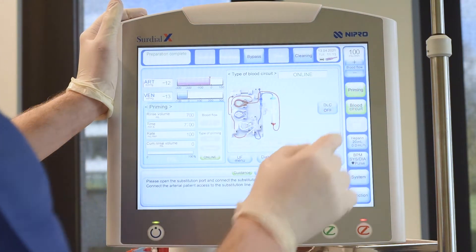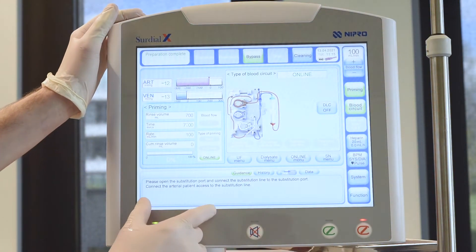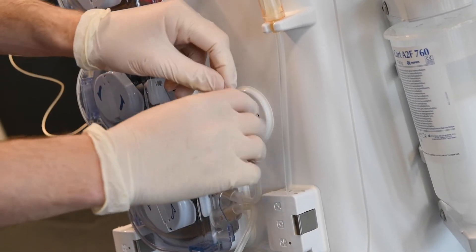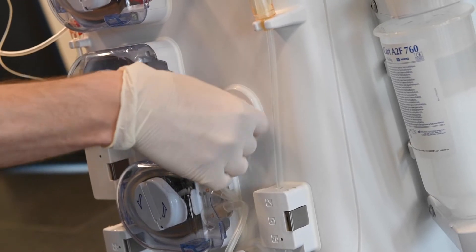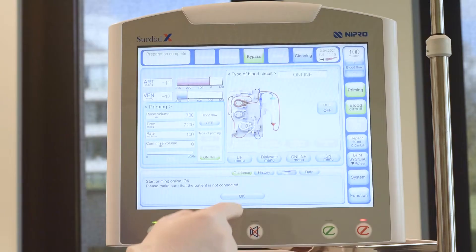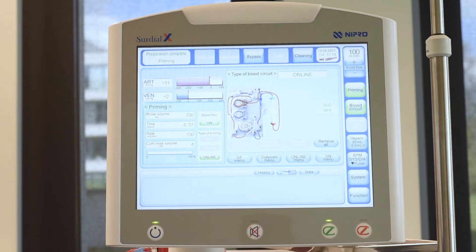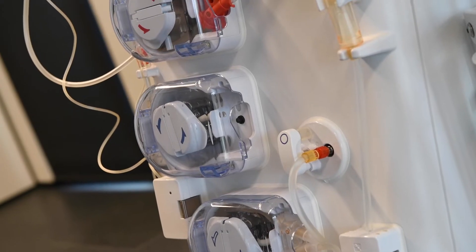Press priming to get to the priming window. Then open the substitution port as prompted and connect the short end of the substitution line. Press OK to start priming. As a HDF line was used, the machine automatically chooses online priming.